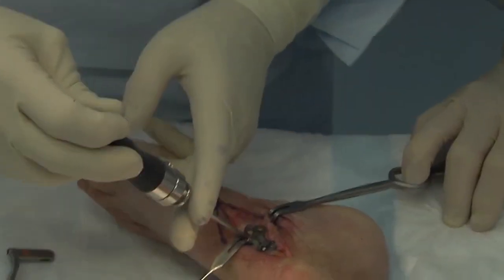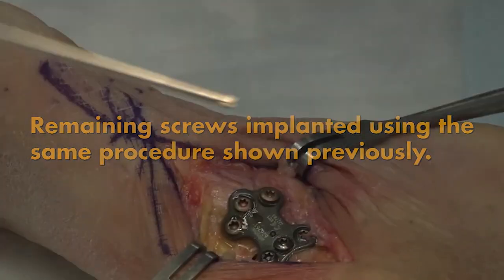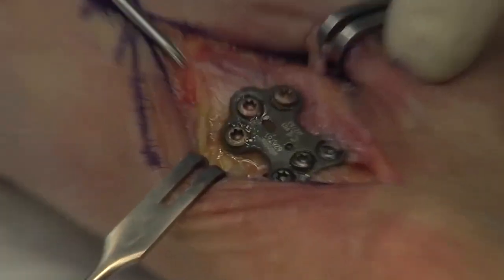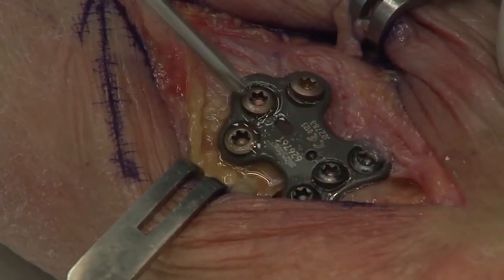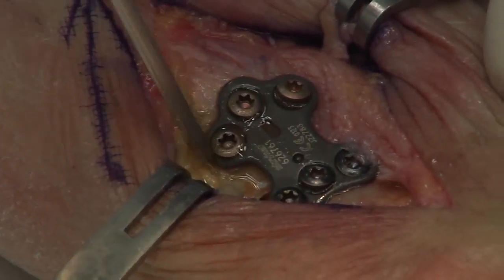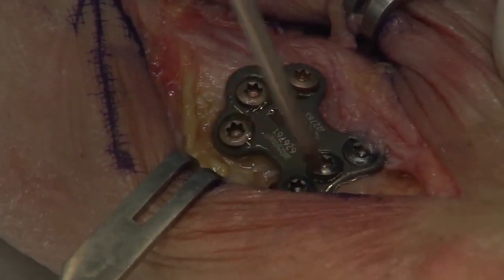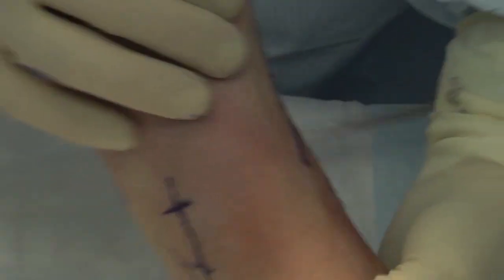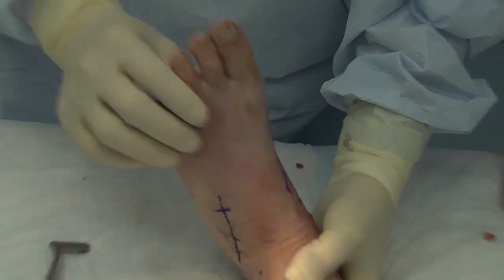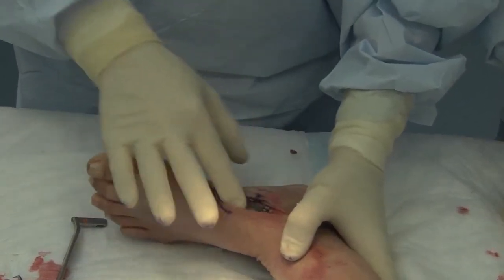What we have here as our final product is a very low-profile plate contoured to fit the anatomical surface of the medial side of the talonavicular joint. Low-profile heads with three screws proximal and three screws distal, arranged in a pattern that ensures you avoid the navicular-cuneiform joint and engage both the talus and navicular in an optimal way. The plate itself functions much like an I-beam — the deforming forces are from plantar to dorsal — giving you an I-beam of maximal strength, lowest profile, in ideal design.